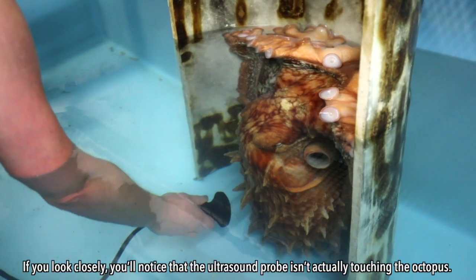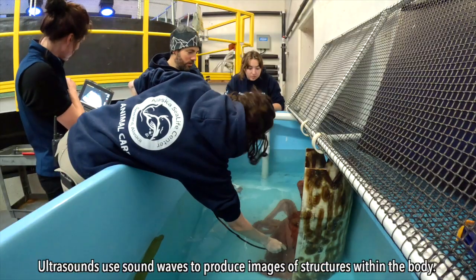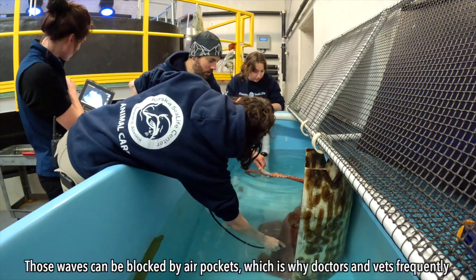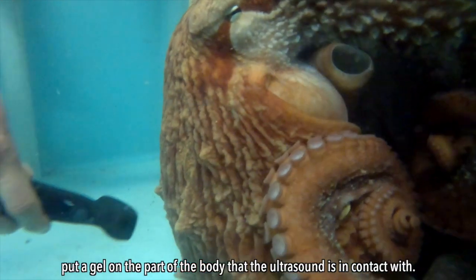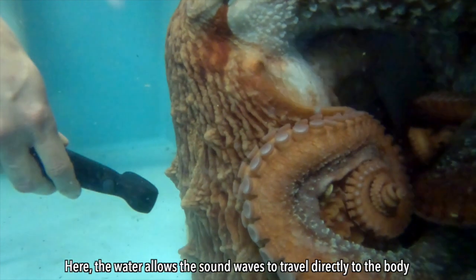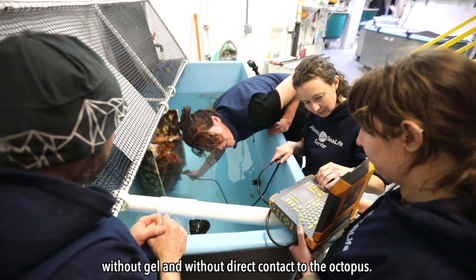If you look closely, you'll notice that the ultrasound probe isn't actually touching the octopus. Ultrasounds use sound waves to produce images of structures within the body. Those waves can be blocked by air pockets, which is why doctors and vets frequently put a gel on the part of the body that the ultrasound will be in contact with. Here, the water allows the sound waves to travel directly to the body without gel and without direct contact to the octopus.